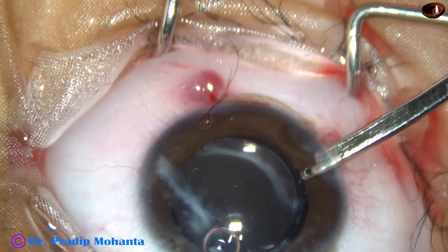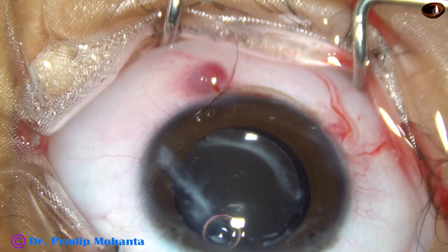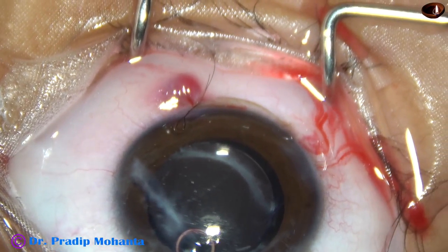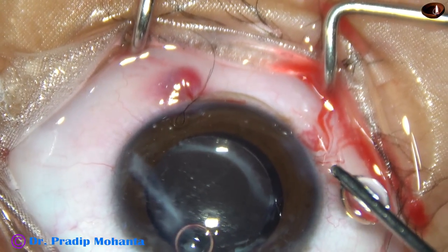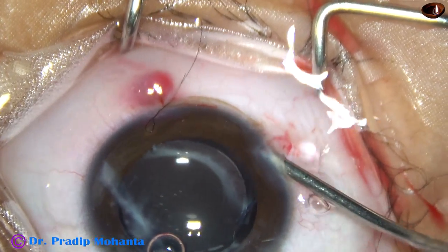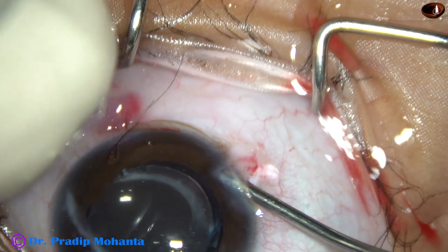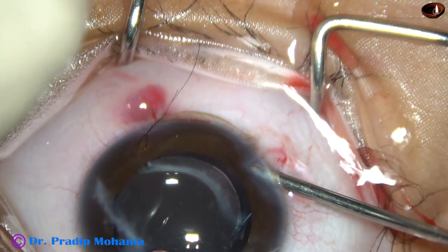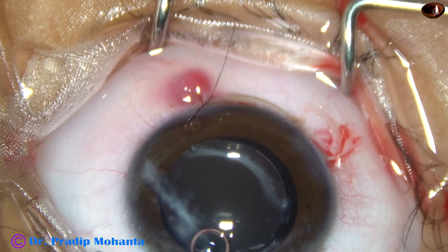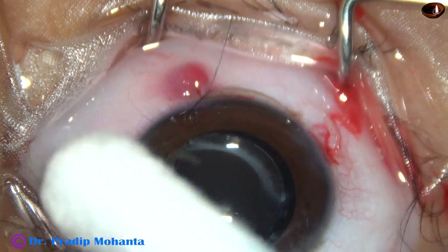This is a little bit of hyphema — it is being removed. I am going to try to form the anterior chamber again. I find that the anterior chamber is again becoming shallow, but I am sure that the anterior chamber will be formed. I am trying to form the anterior chamber with this irrigating probe. First clean the site. I find that there is no leak. The anterior chamber is on the higher side and the surgery is done. This patient did very well after surgery.